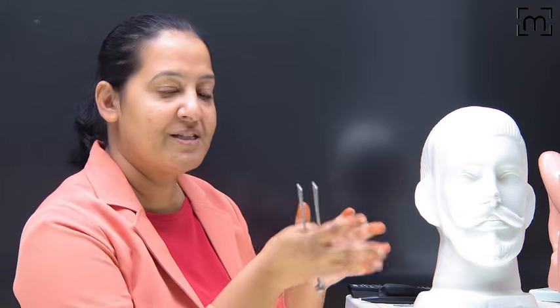Normally, it is equal. So the patient hears for 10 seconds, I am also hearing for 10 seconds. The patient doesn't have any deafness, if I am considering myself normal. So if both of them have equal duration, that is normal. But in the patient, it is 5 seconds, and in me, it is 10 seconds. So why is it less in the patient? It is for a shorter duration.